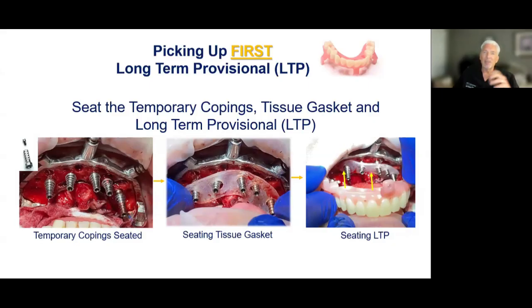bone foundation guide. Some companies make them out of plastic. We still do too. We usually only do that for the sake of time. It takes longer to make a metal guide than a plastic one. But we like the metal. It's lower profile, stronger. But either way, just a little sidebar conversation with you there.